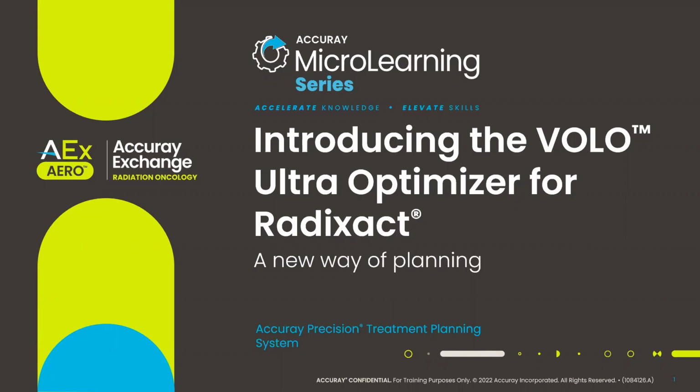So let's go ahead and get started by giving you a little background about myself. I've been a radiation therapist since about 1993 and started doing dosimetry about 7 years later. Then in 2004, I began working for TomoTherapy when there were only a couple Tomo machines installed. I joined the company because of its new leading edge technology. I was really inspired by what it meant for patients and the changes that it could bring to the field of radiation oncology. And those changes did occur. I mean, there were huge improvements throughout the industry. So I'm proud of our company and our products that we have provided over the years.